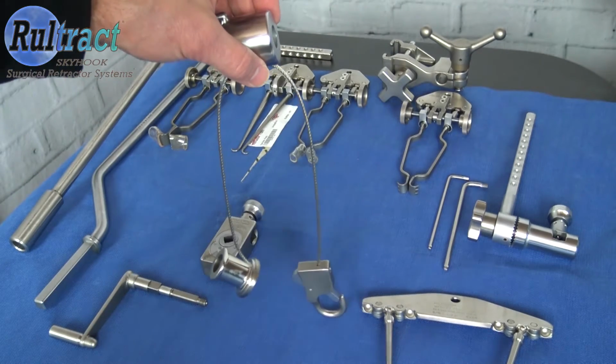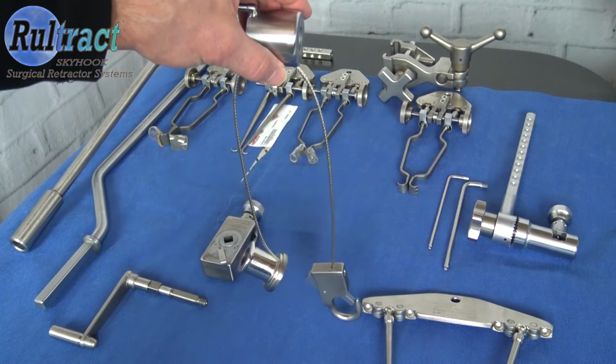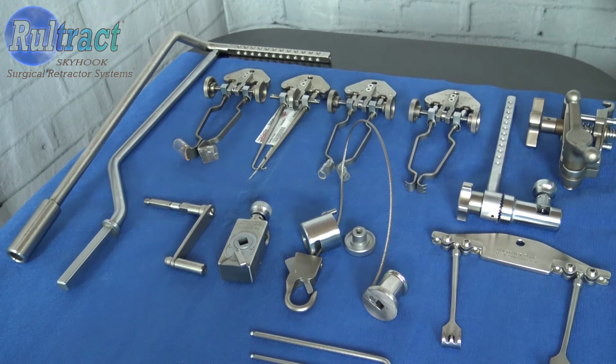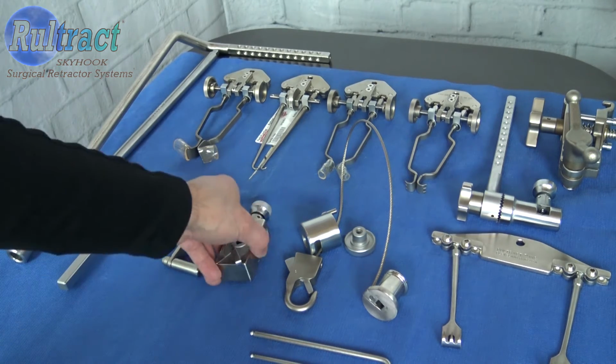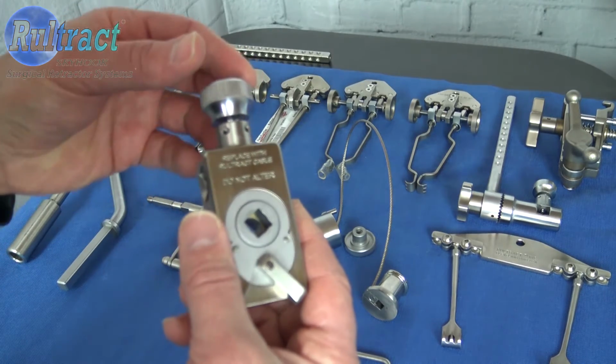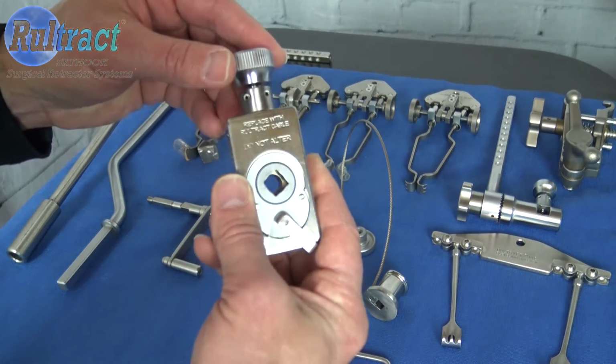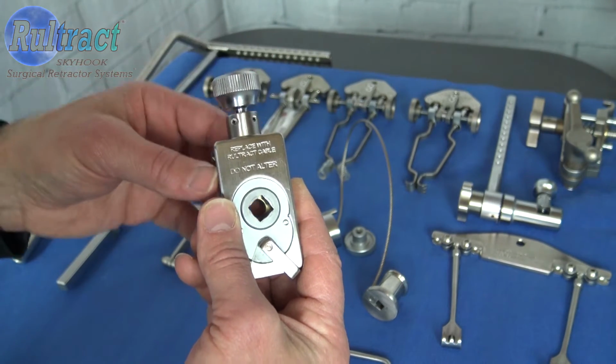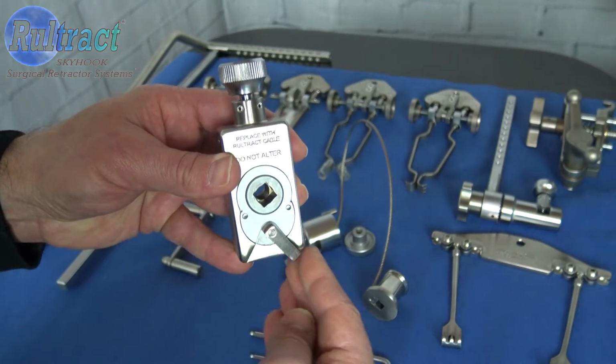Now these 3 pieces here require no further disassembly for cleaning or sterilization. Your Rultract ratchet rake assembly is now disassembled into the 5 pieces. Now it's important to note here that no further disassembly is required of any of these pieces for cleaning and sterilization. So the next thing that we're going to want to do prior to putting the equipment through the cleaning process is make sure that your lock knobs are not opened or closed all the way. You want it to be somewhere right in the middle so that it has some play in it. If it's closed or open all the way, it could seize in that position as a result of the heat of cleaning and sterilization.